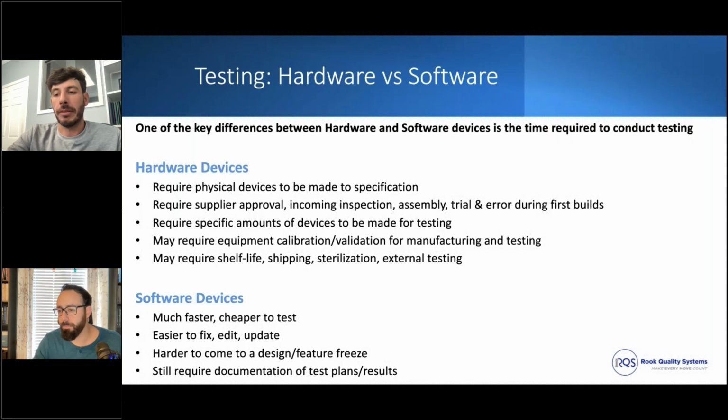Yeah, I know we've seen a few times with mold release agents, making companies, all the materials they bought are biocompatible and tested by themselves, and then they put it in the mold, and the mold release agents make it fail. So there is some of that that's also required. Even if you think all the materials are good and safe by themselves, the process of actually testing the final device and how it'll be used is important as well, because there are things that can affect that testing, whether it's handling, mold release, cleaning procedures, all of that stuff can affect this as well.